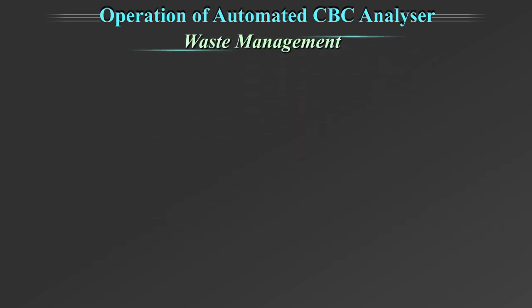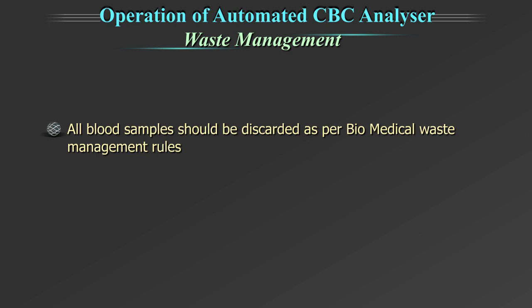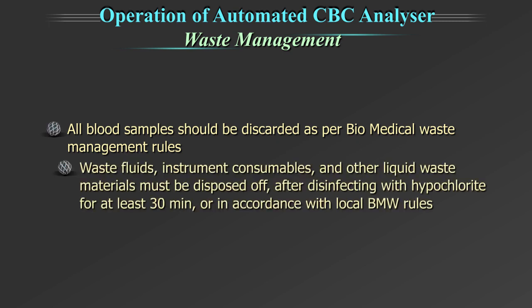Waste management. All blood samples should be discarded as per biomedical waste management rules. Waste fluids, instrument consumables, and other liquid waste materials must be disposed of after disinfecting with hypochlorite for at least 30 minutes or in accordance with local biomedical waste rules.